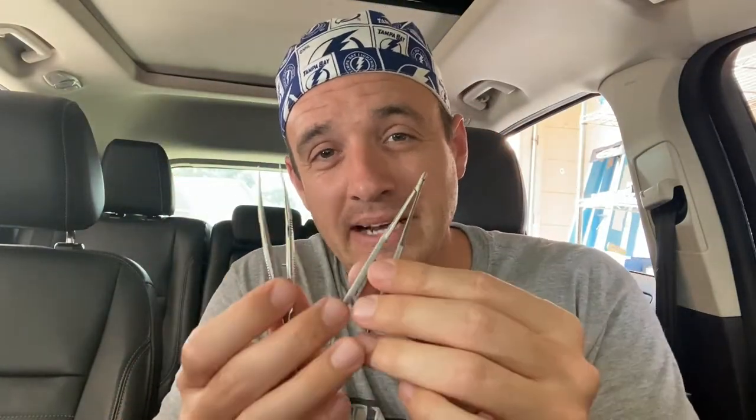Op the Limpo back with another leaky video. Today is another episode in microsurgery pitfalls.